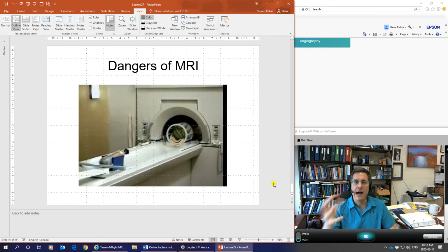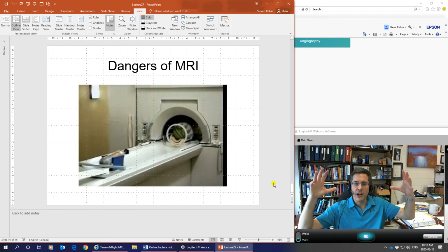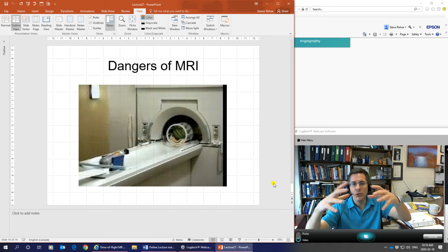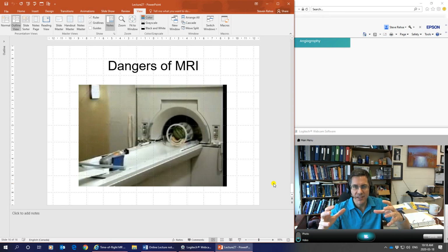The gradient is turning on, off, on, off. And when dB dt is large, it means you're trying to apply a huge magnetic field with the gradient coil, and you turn it off. On and off, and on and off. Every time that happens, that's a change of field. It's a change in flux. And any metal loop does not like to have a change in flux, so it's responding to it. That banging sound is actually the gradient coils trying to tear themselves out of the MR machine because you're forcing current through it and turning that field on and off, and these things hate that.